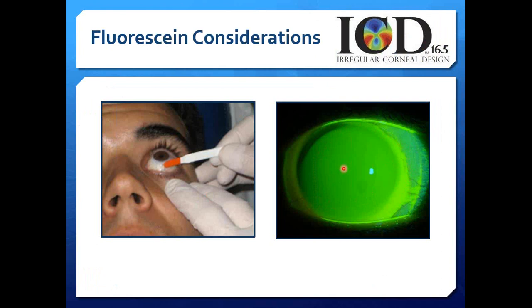If this is a 4,500 micron lens and you fill up the bowl full of fluid, then you use your fluorescein strip and place that lens on eye. Of that 4,500 microns of fluid and fluorescein between lens and cornea, you're going to squeeze the majority of that out and leave only 400 microns of your 4,500, and you're going to have very little of the fluorescein left. So put lots and lots of fluorescein in the bowl prior to insertion.